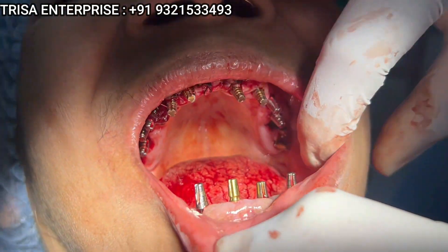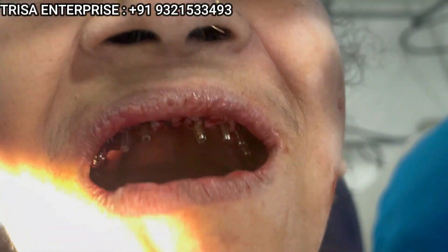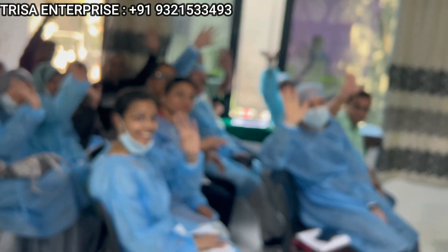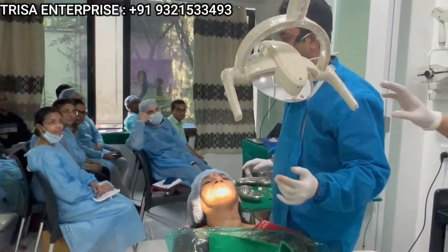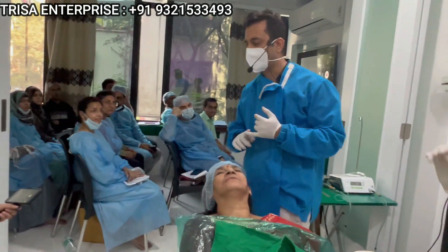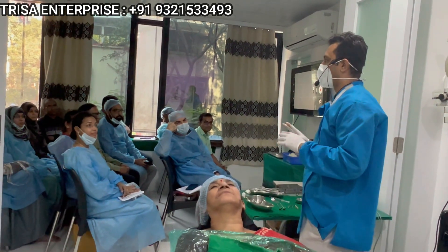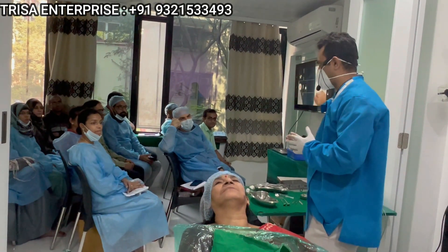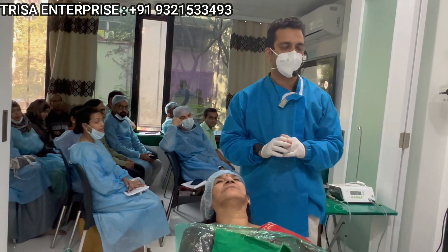Upper and lower jaw complete flapless implants have been placed. Thank you all for joining us. Right now I am going to demonstrate technique number two — technique number one we already discussed yesterday on how to take jaw relation. This technique is called the dual ring technique for taking good, accurate jaw relations. Let me quickly demonstrate how to take jaw relation in full mouth basal implant patients.